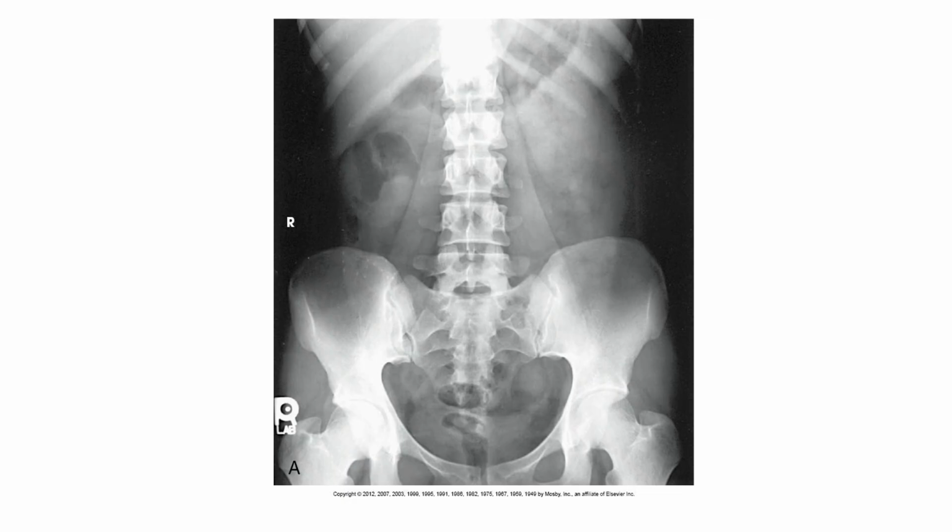You can see the bottom end of the triangle is kind of pointing at that small letter R in the right middle border. That little point of the triangle is the bottom corner of the liver. It kind of tracks with that 11th rib there, runs parallel to that 11th rib.